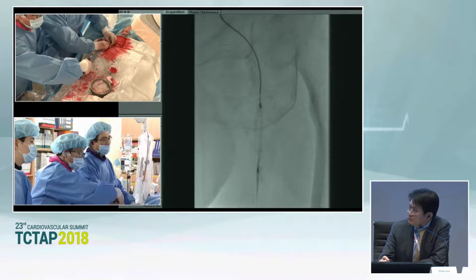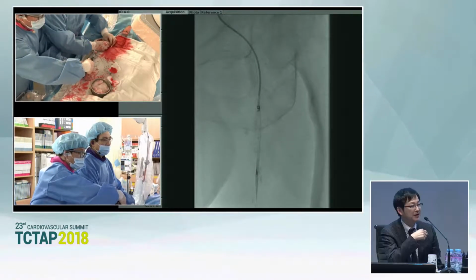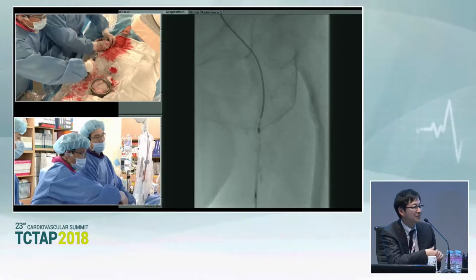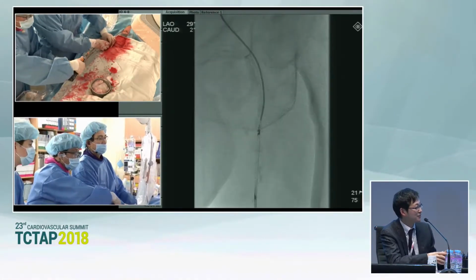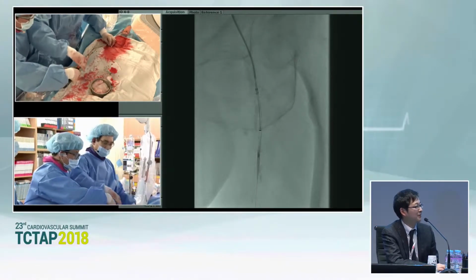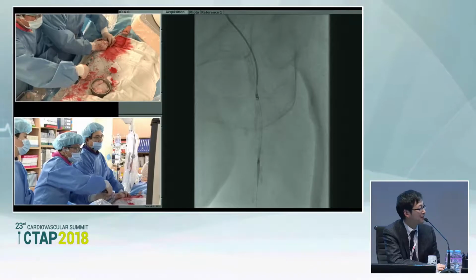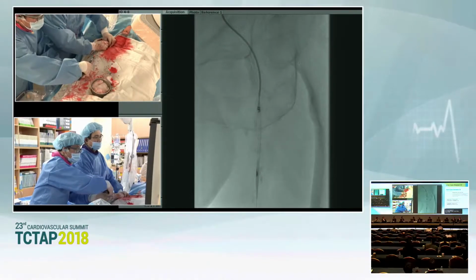Dr. Cho, I have a brief question about revascularization for the common femoral artery. In the clinical setting, in general, the common femoral artery is a good indication for surgical revascularization. In Japan, we don't have the atherectomy device, so we just discuss with the vascular surgeon. With the improved atherectomy devices, are common femoral arteries commonly treated by endovascular atherectomy with DCB? Maybe it depends on the hospital situation.